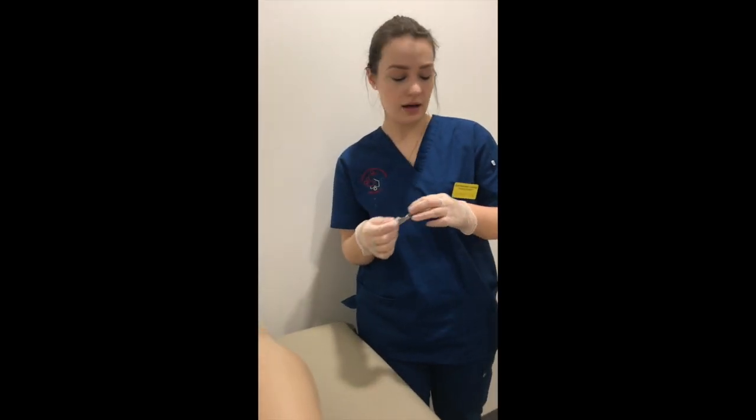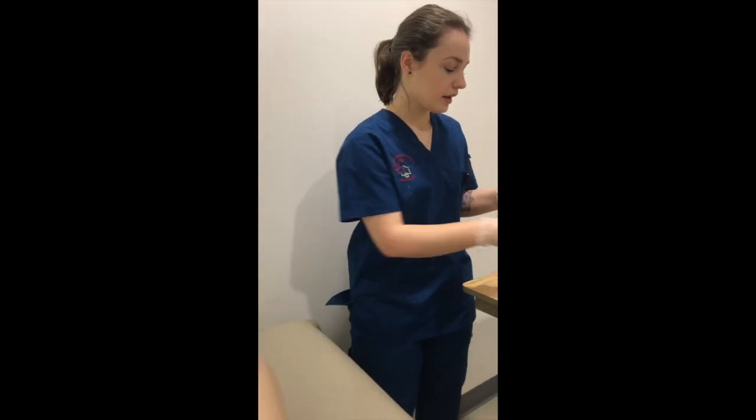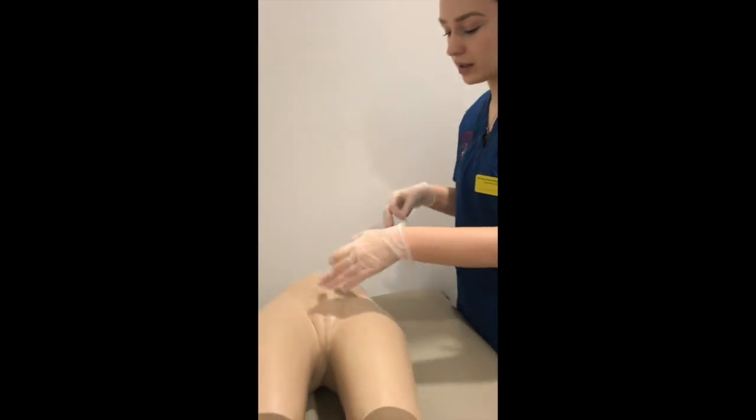So we're just going to take an alcohol prep wipe, and we're going to start by cleaning the area. So I'm going to go for Mr.